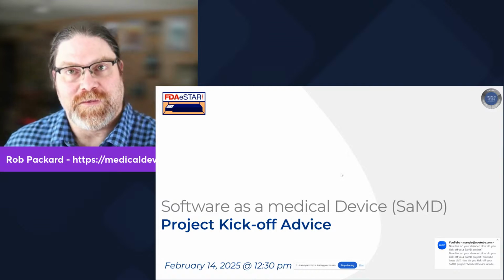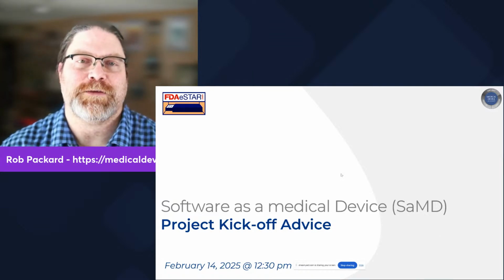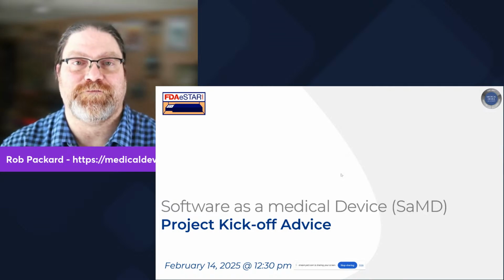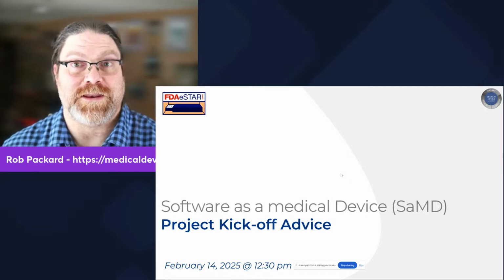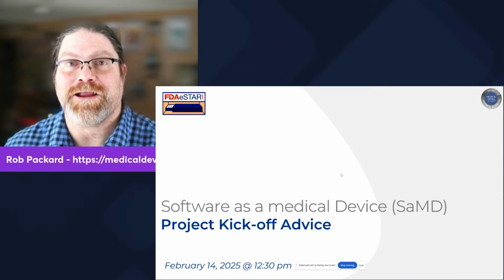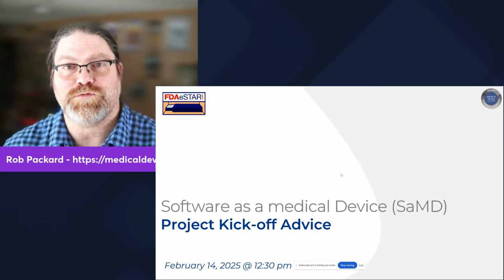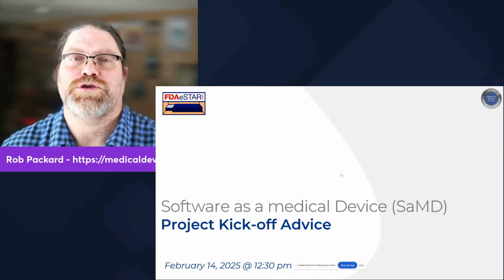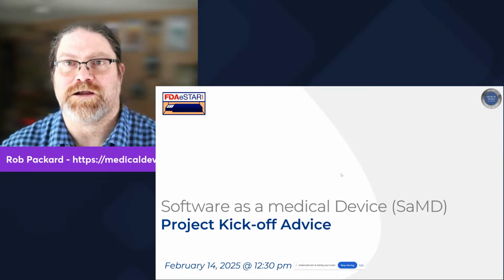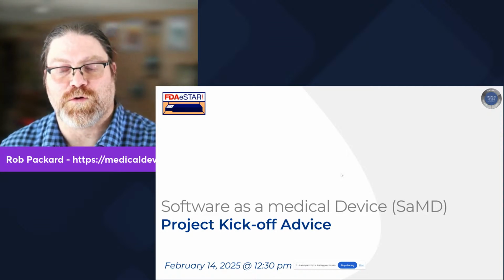to agree this is okay, this is cleared for marketing in the US, because you need to be able to validate the software. And there's a specific set of standards that you have to follow when you want to validate software for a medical device. So before you go and hire somebody to write your software, if you have your own expertise, before you develop any code whatsoever, you need to do a couple of things first. And that doesn't mean build out an entire quality system, build a DHF. You need to do a few things first before you jump in.